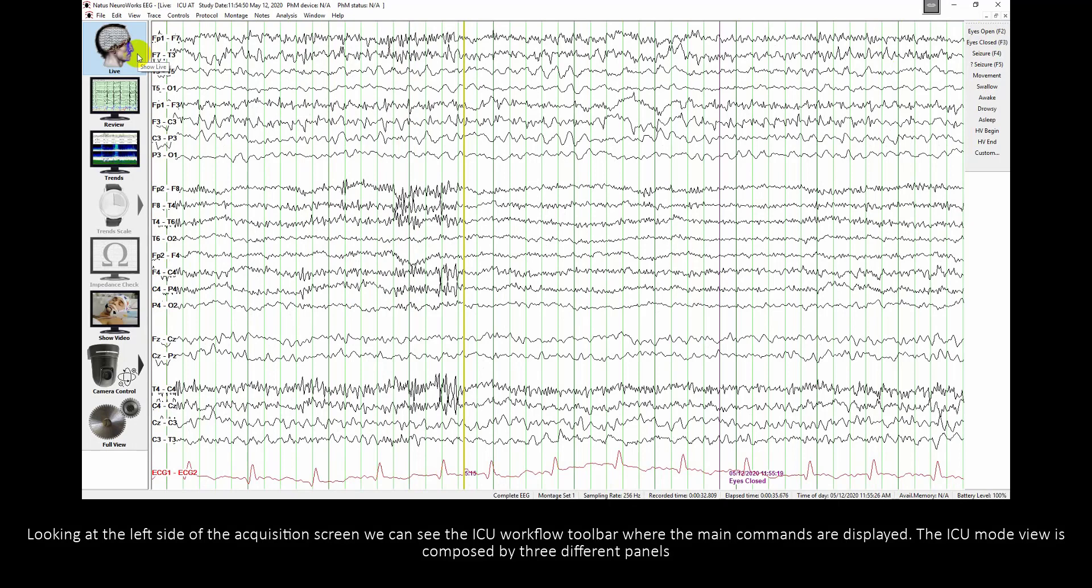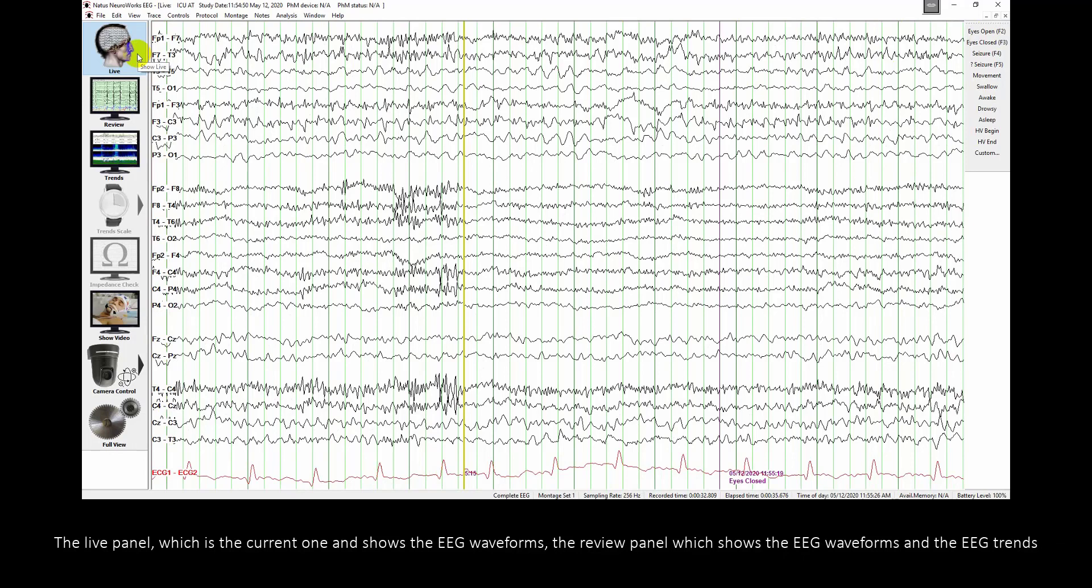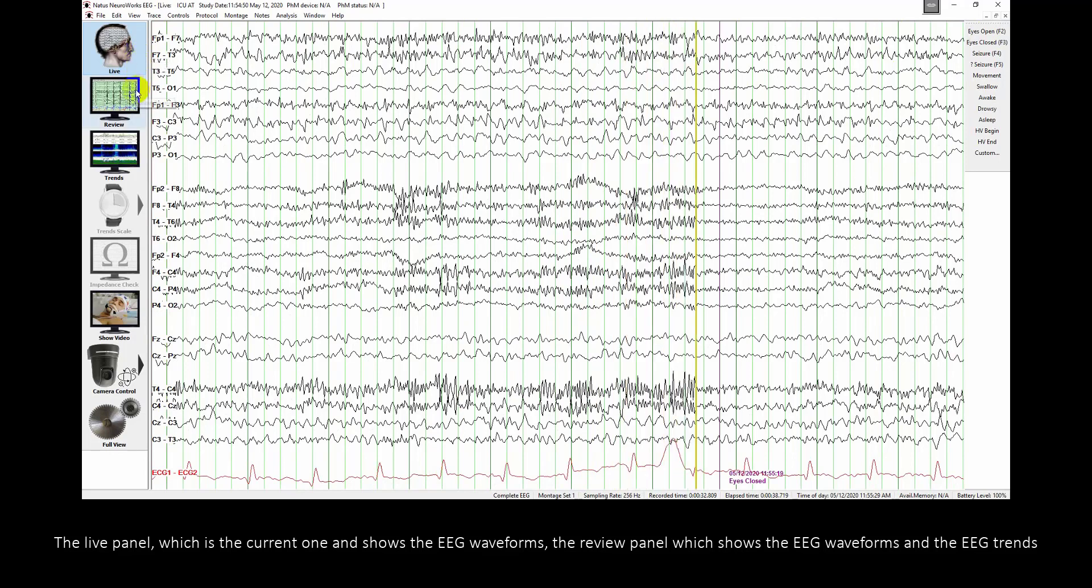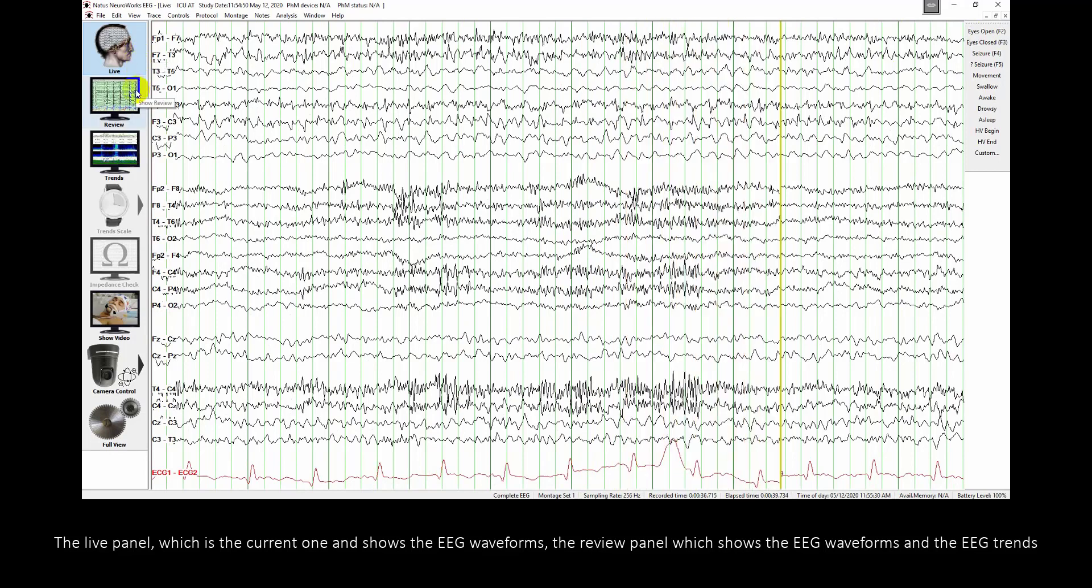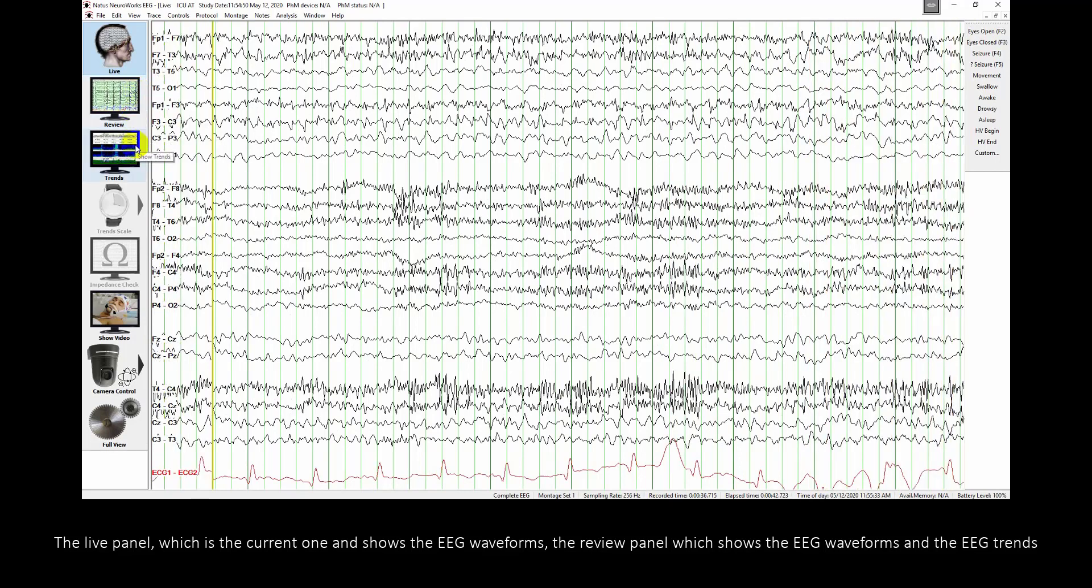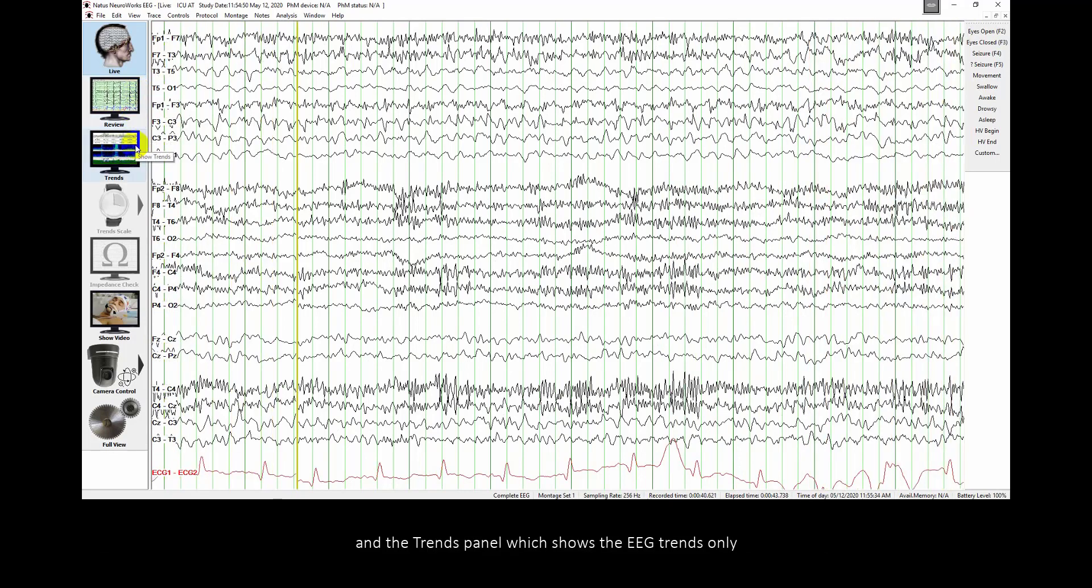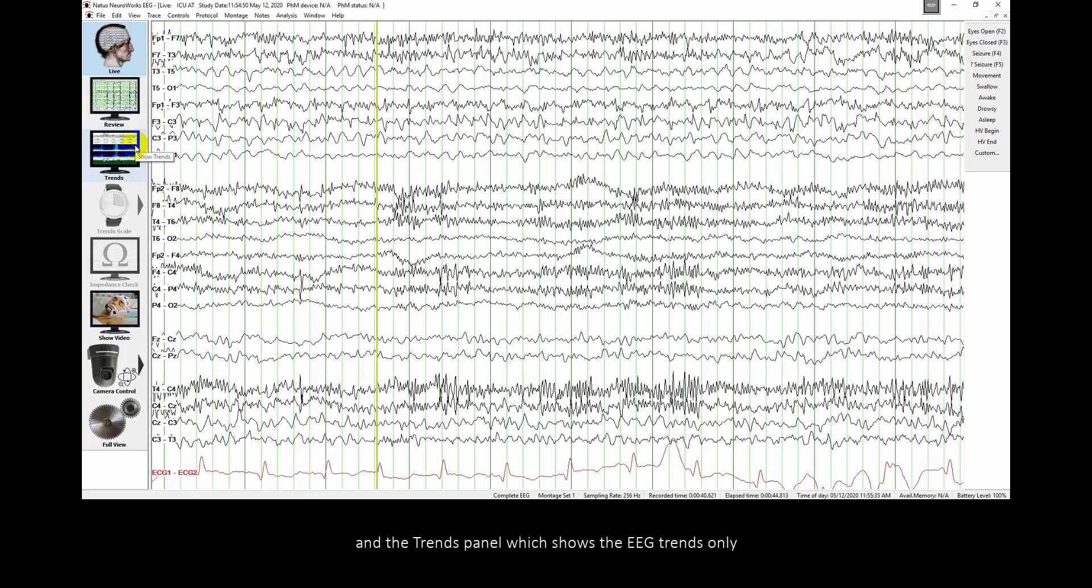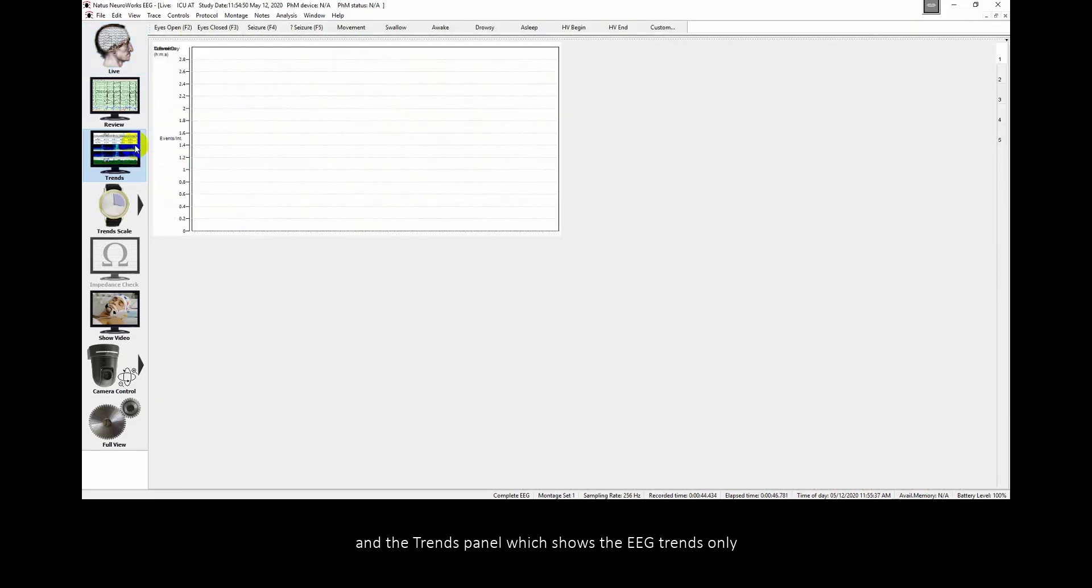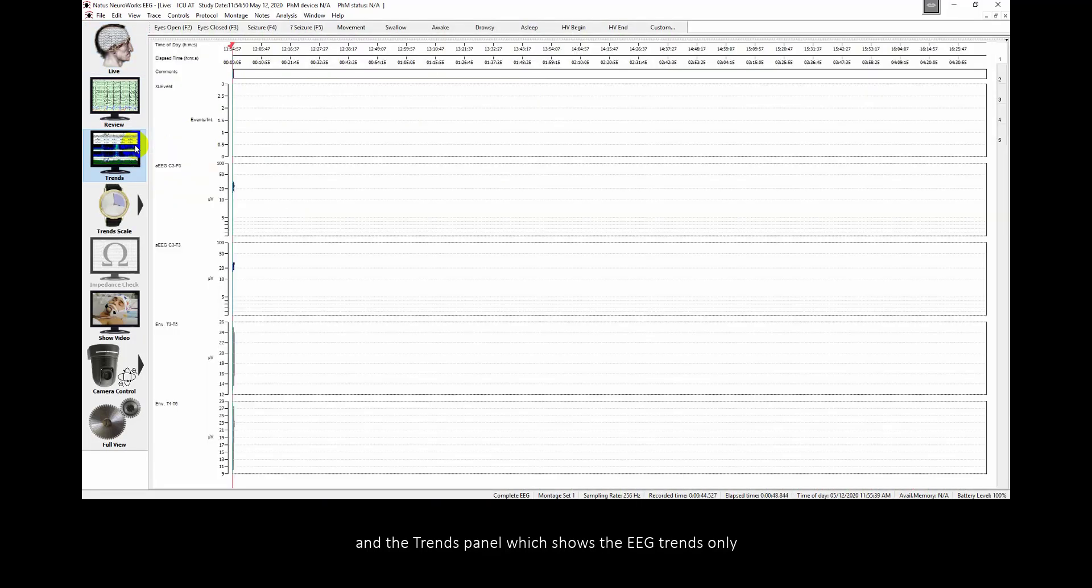Looking at the left side of the Acquisition Screen, we can see the ICU Workflow Toolbar, where the main commands are displayed. The ICU Mode View is composed by three different panels. The Live Panel, which is the current one and shows the EEG waveforms. The Review Panel, which shows the EEG waveforms and the EEG trends. And the Trends Panel, which shows the EEG trends only.